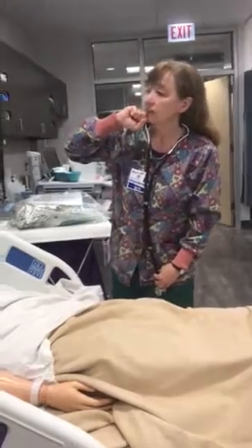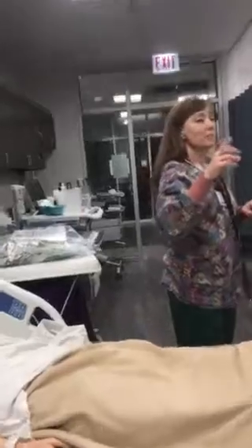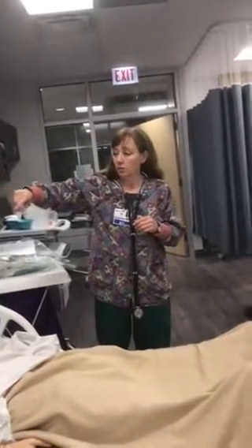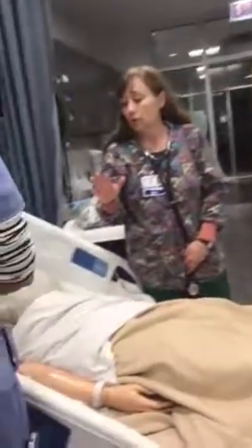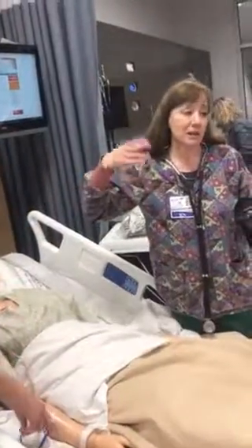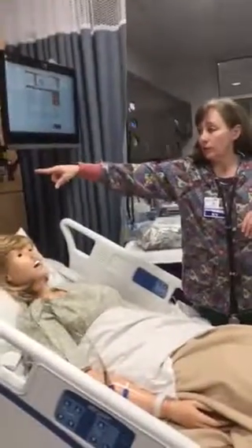we don't even have our regulator. Right. Okay. Brand new. We would check our regulator, and what we're checking for is if she's supposed to be on low intermittent suction, we're making sure that that works. So we start with the far wall when we do our assessment. You want me to hook it up? Sure, and if she is hooked up, that would be hooked up to her NG tube when you walk in the room. So she's gonna disconnect that, and normally you would see this all hooked up. And you might even see a chux underneath, because in case it would get disconnected, then it would be a huge mess all over the place. So this would be hooked up to your regulator.